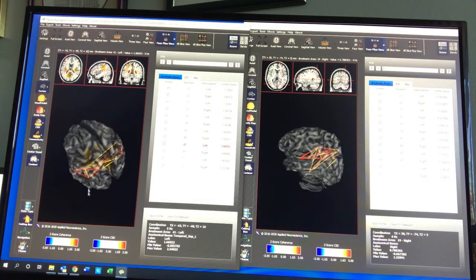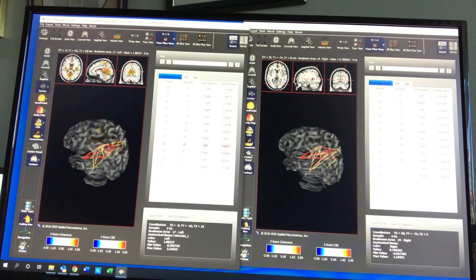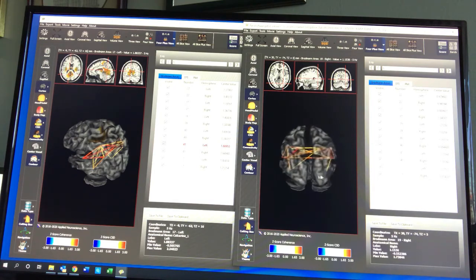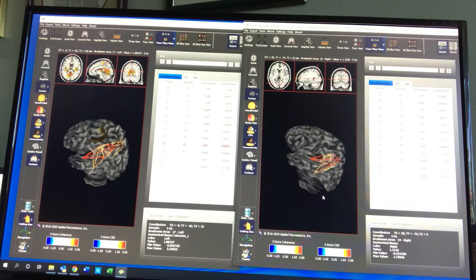Here we are at 5 hertz. This is, again, her baseline, and we see tremendous problem with very high amplitudes of 5 hertz. And the image on the right, here we go, 5 hertz. We can see the images on top, the LORETA, the low resolution brain electromagnetic tomography, that's normal. So 5 hertz is normal for this patient after 10 sessions, but the connectivity is still a problem. We can see that needs additional work, and that's why we will continue always.